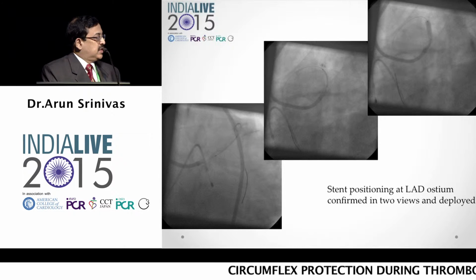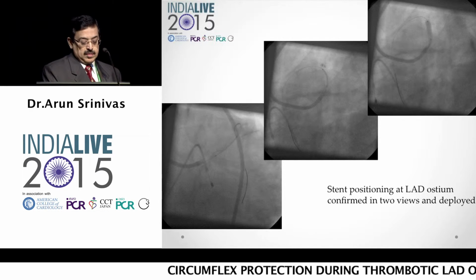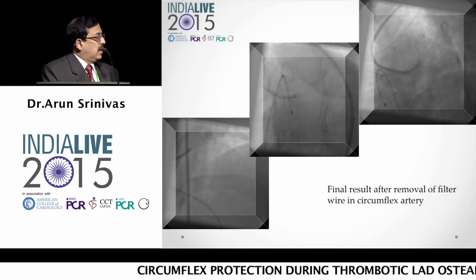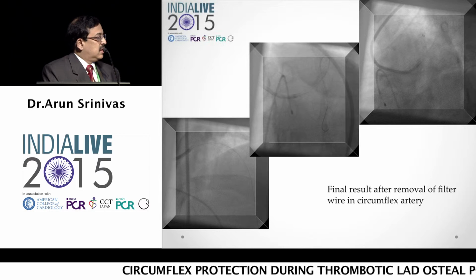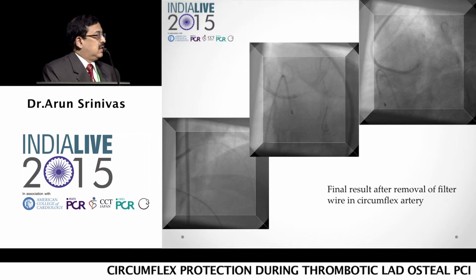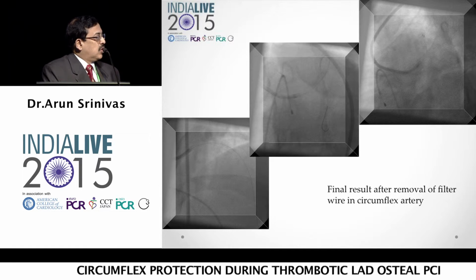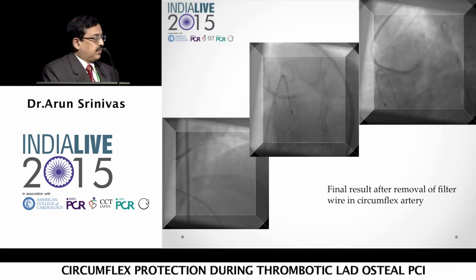A stent was positioned into the ostium of the LAD artery, confirmed in 2 views, and this is the stent deployment. And the final result after stent deployment and removal of the circumflex filter wire.